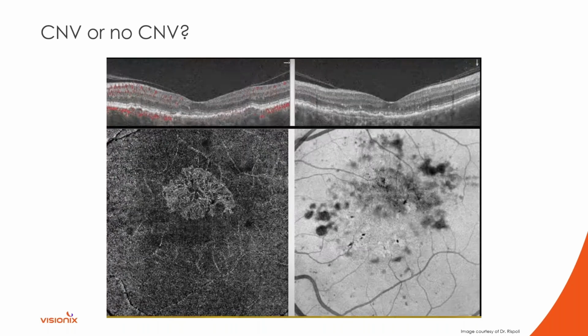Here again, we've got some B scans and they don't look all that bad to me. The RPE certainly doesn't look healthy. We might have a sick RPE here, but who would have thought, looking at these B scans, that this patient had a choroidal neovascular membrane? Well, guess what? They do. So, nice examples here of what would you think if you saw this.